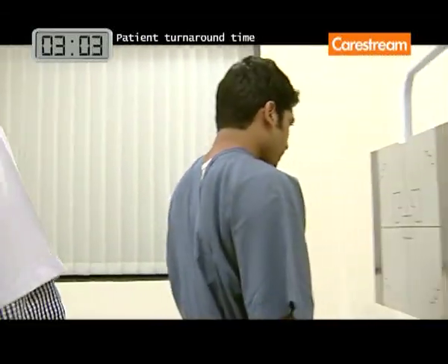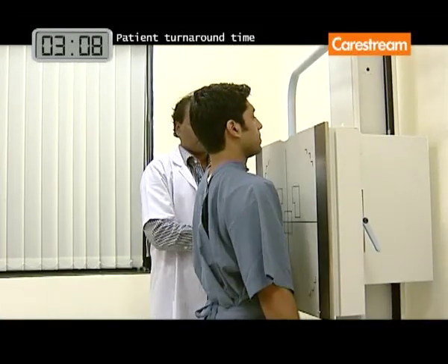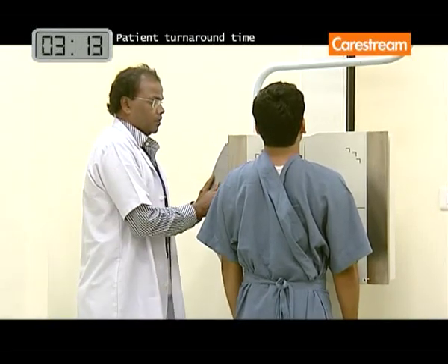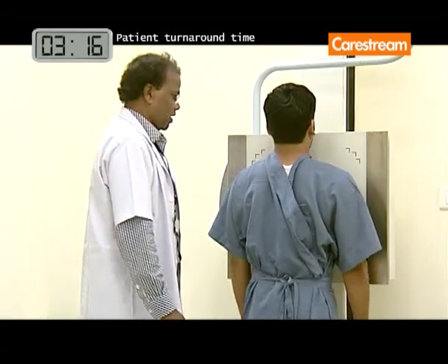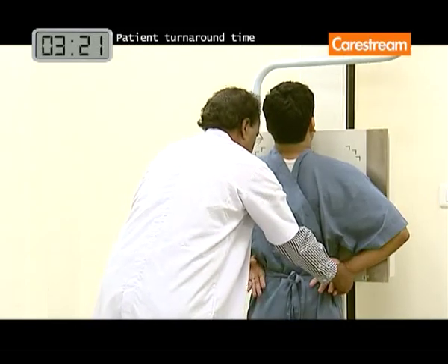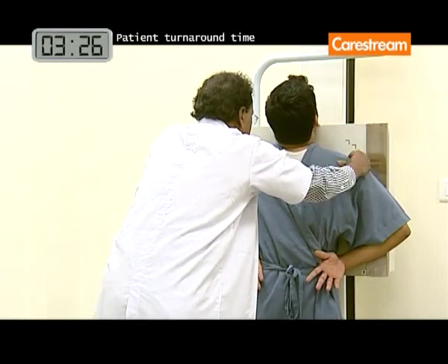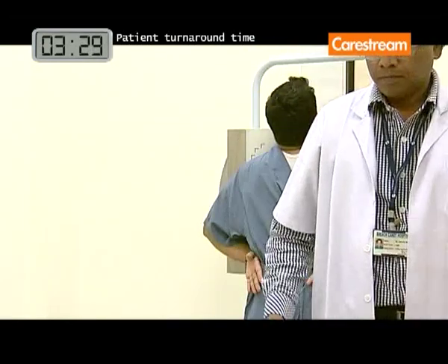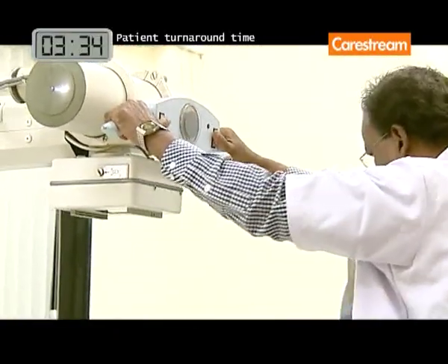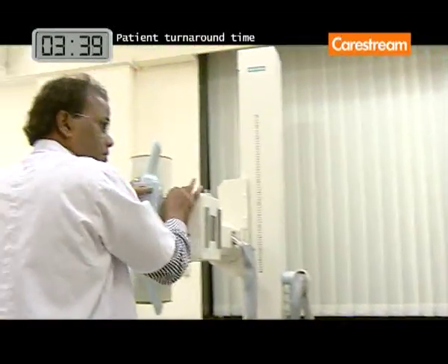There is no need to modify your generator or bucky, discard your wall stand or table, replace grids, or radically alter procedures. The DRX-1 system is suitable for any general projection radiography imaging applications.